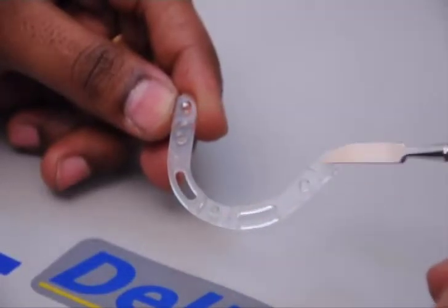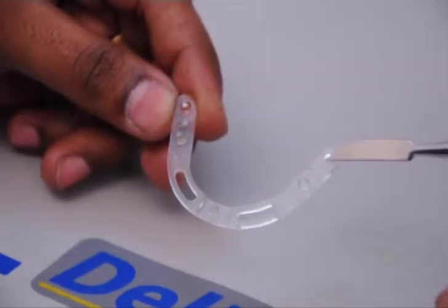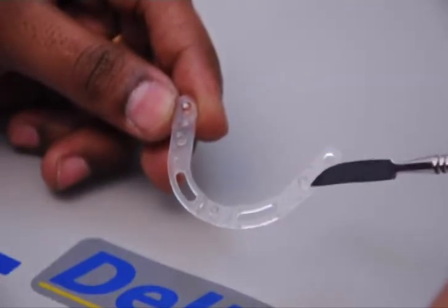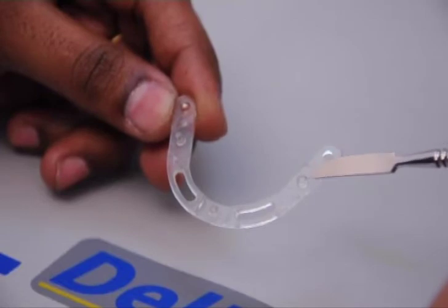This is the tracing retainer. The tracing retainer also has retentive slots and retentive grooves. It is into this that the visible light cure material is added, with the help of which it can be attached to the denture base. It also has retentive tags, with the help of which we can attach the plastic bite rims and also the tracers later on.